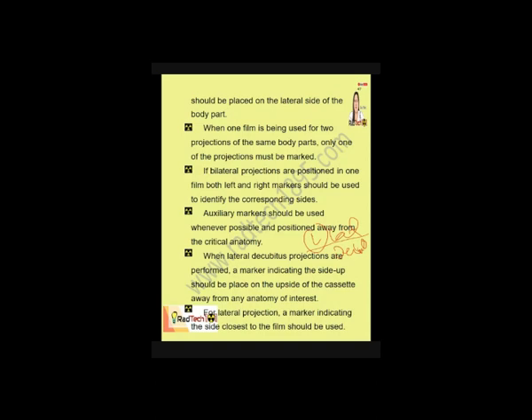Yung kanyang right portion nasa taas. Diba? Kasi left lateral decubitus. Yung left niya nasa table, yung right niya nasa taas. So, ang ilalagay natin na marker is right na marker. Kasi yung right side ng patient ang nasa taas. Okay?